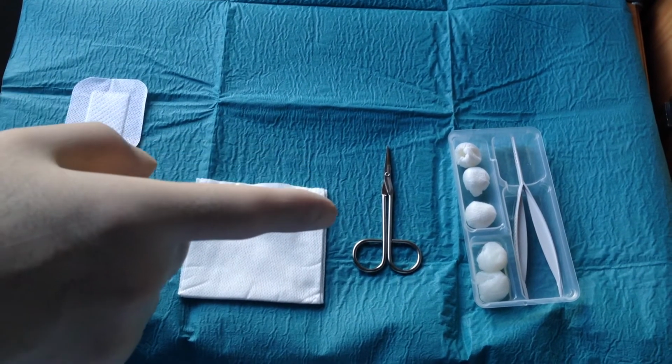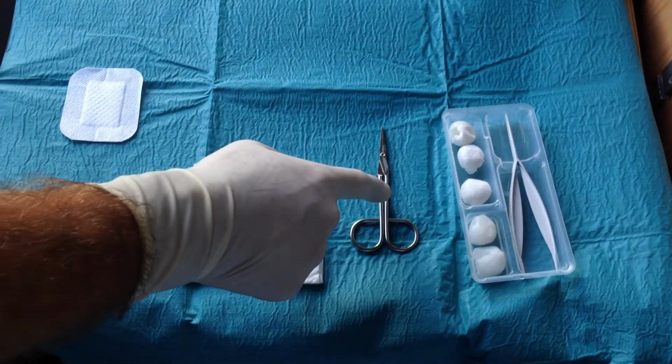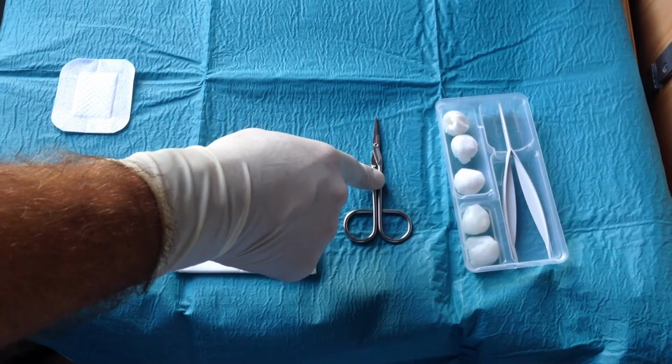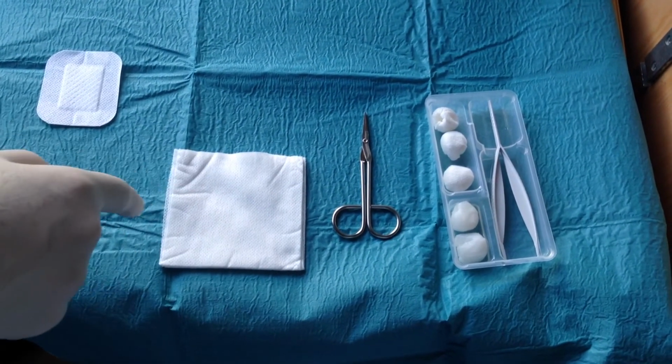To remove the midline and SecurAcath fixation, you need some cleansing. Maybe you need a scissor to cut the SecurAcath in two pieces, and you need some kind of plaster for afterwards.